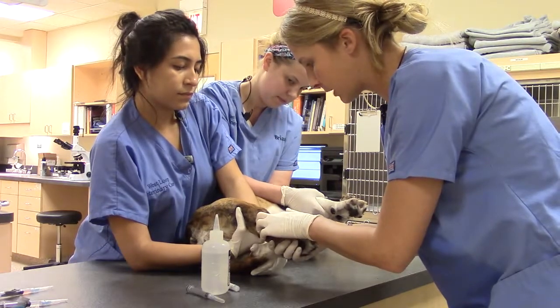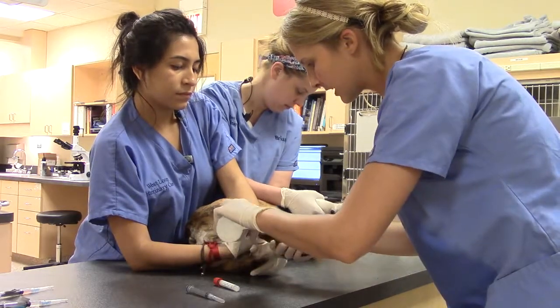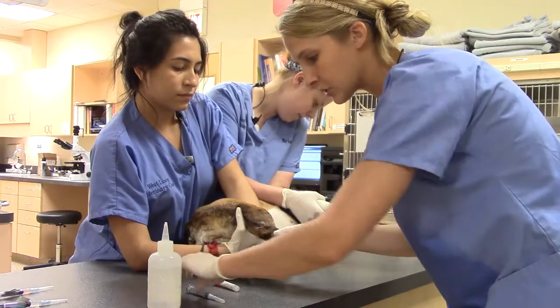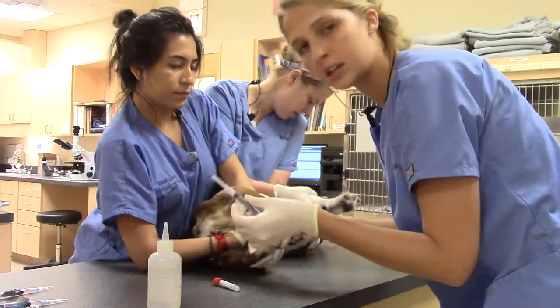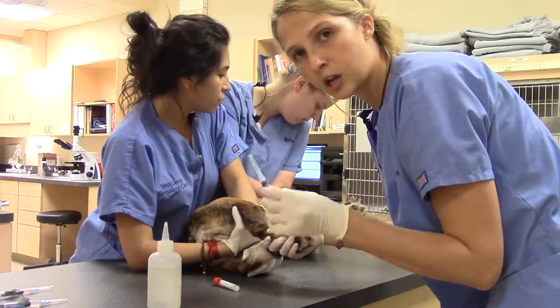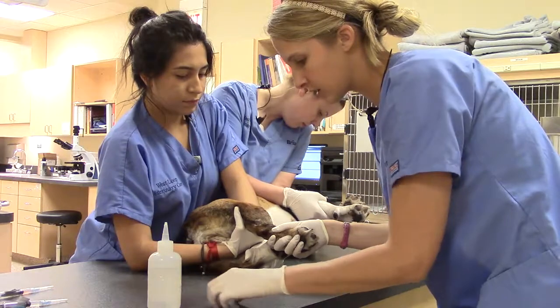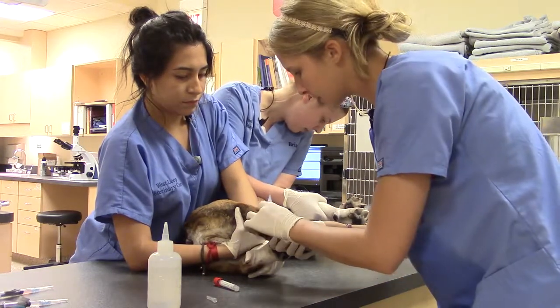I've gone ahead and held and palpated the vein, which is right there. I'm going to use some alcohol. When I go to poke, I'm going to make sure I use bevel up. I'm using a 22-gauge needle on a 3-mil syringe. Monce is putting pressure on there to make sure that the vein pops up.